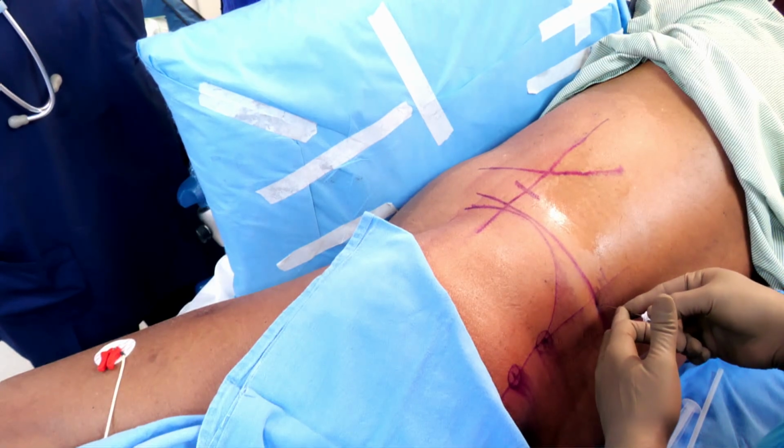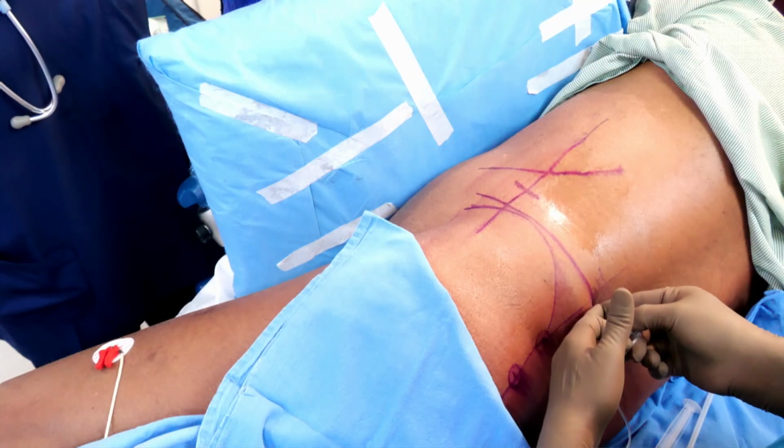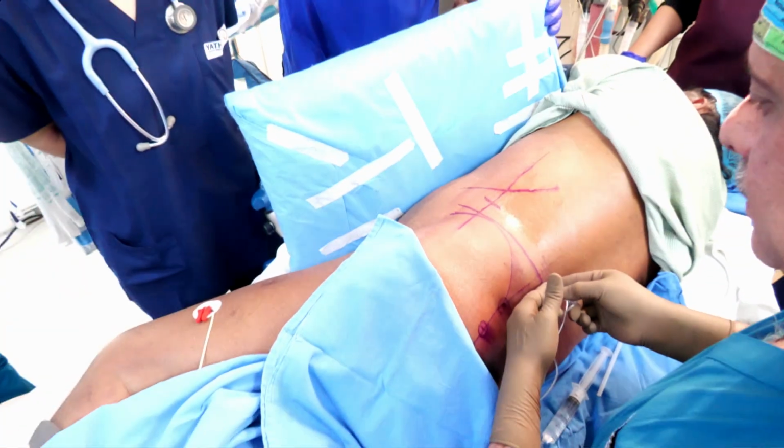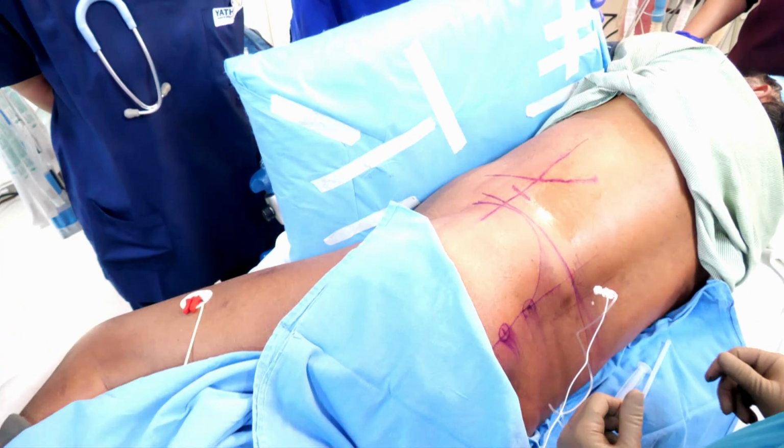So this is probably the transverse process. I am keeping around 2 centimeters. I am going cephalad. We are able to see the twitches. Yes, so these are the contractions.